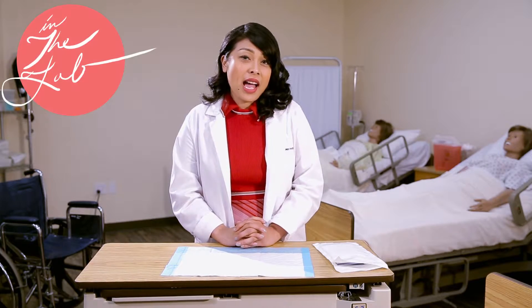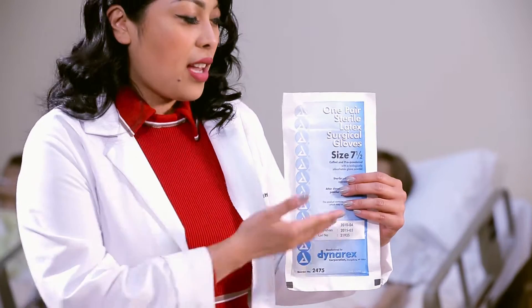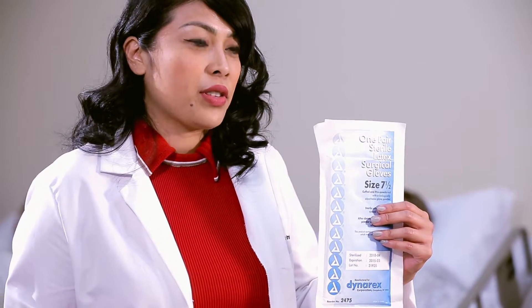Welcome back to Angela's Institute's Skills Lab. I'm Miss Christine and I'm going to show you the proper technique of sterile gloving. First, you want to make sure that the gloves are the perfect size. I am a seven and a half, and this is a seven and a half size for sterile gloves.